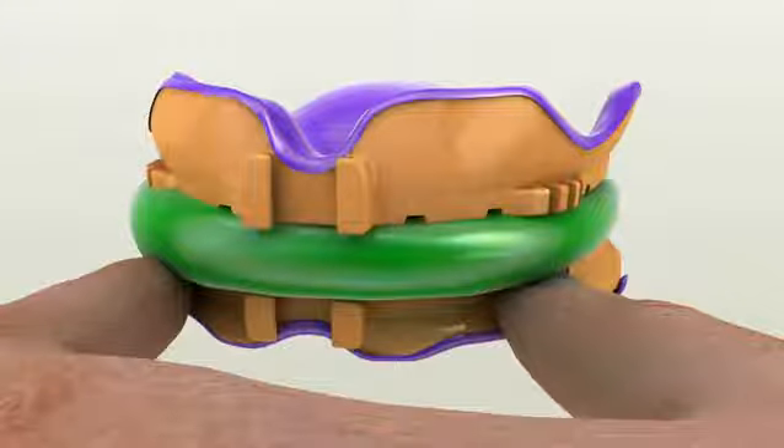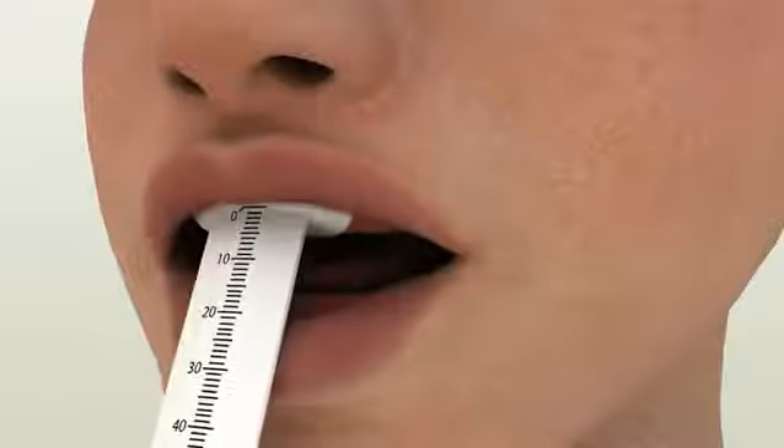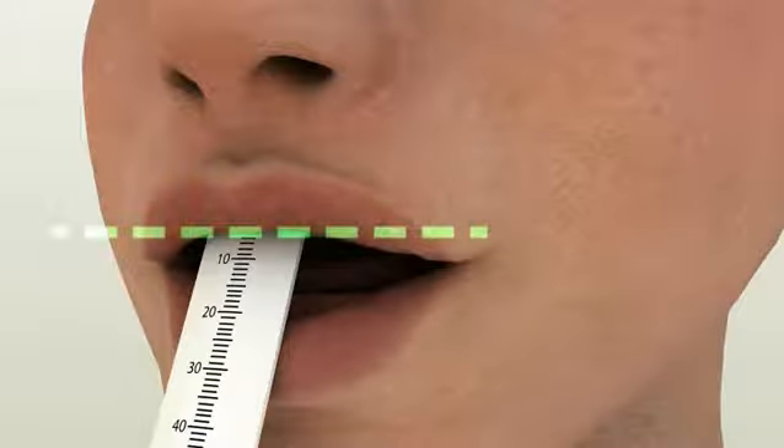After the bite registration material is set, remove the entire piece from the patient's mouth. Send these impressions as attached — remove the entire piece from the patient's mouth without attaching any parts. Measuring the upper lip length: utilizing the DENTCA lip ruler or any lip ruler you have, measure the upper lip length.